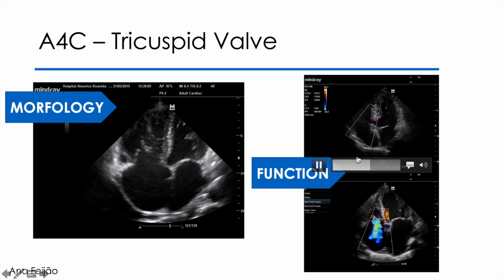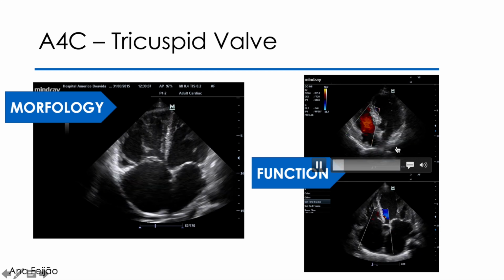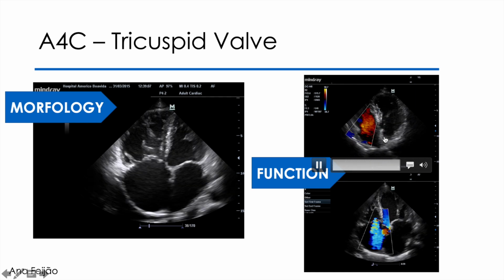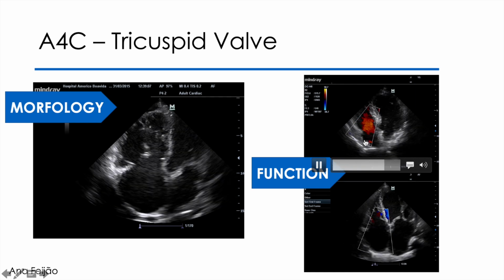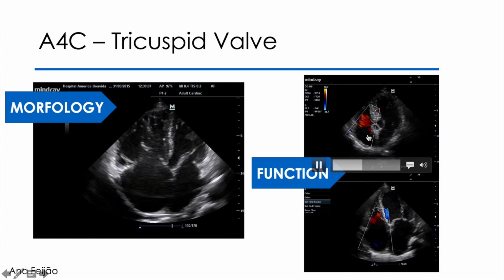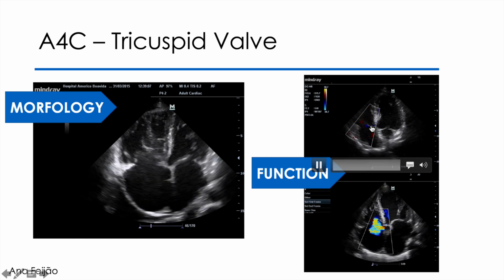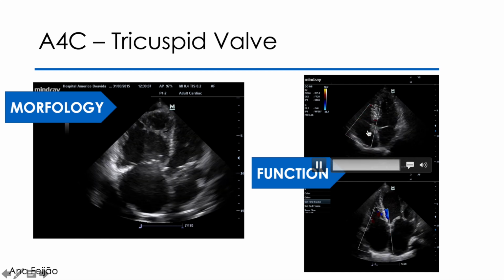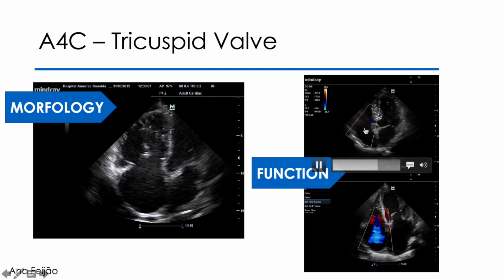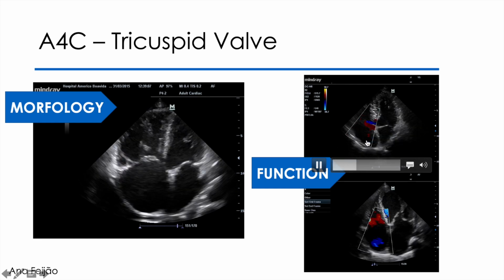Calling the Doppler window, I lower the overall 2D gains and I orient the sector size so that the tricuspid valve is in the middle. You should be able to see diastolic flow and regurgitant flow. In these two examples, we can see an example of a slight mild regurgitation appearing coded in blue, taking into account that it is a flow that moves away from the probe, right ventricle to right atrium flow.